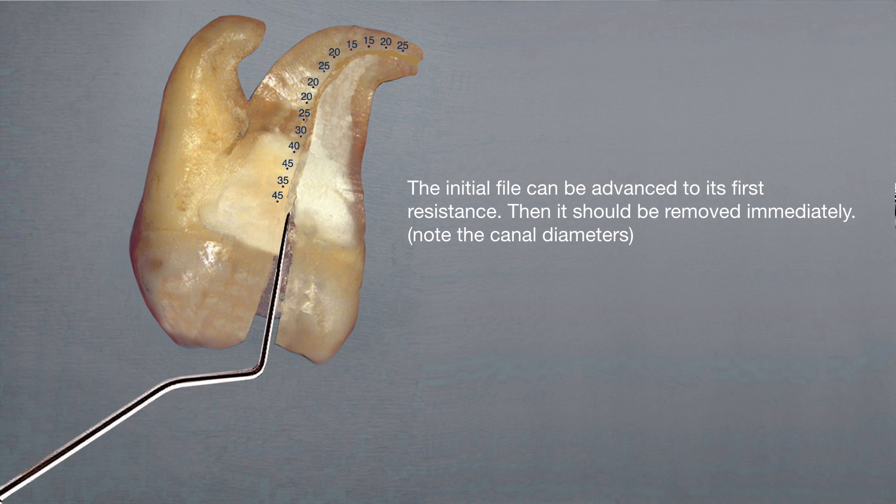The initial file can be advanced to its first resistance. Then it should be removed immediately. Note the canal diameters indicated alongside the canal.